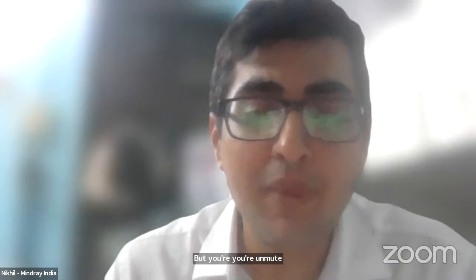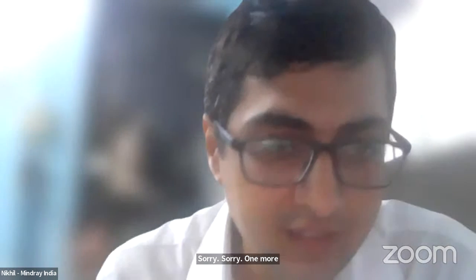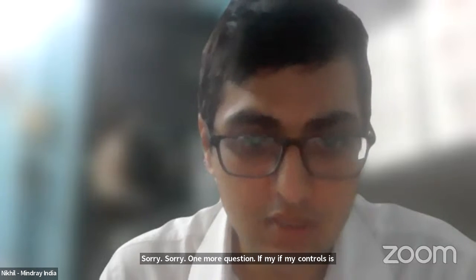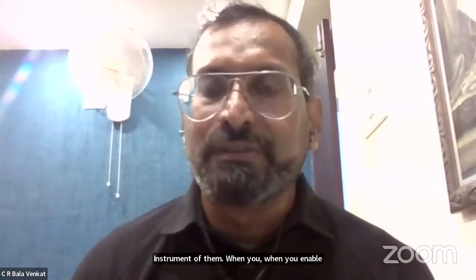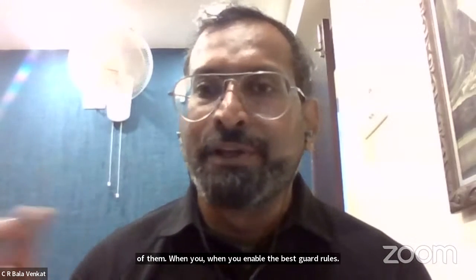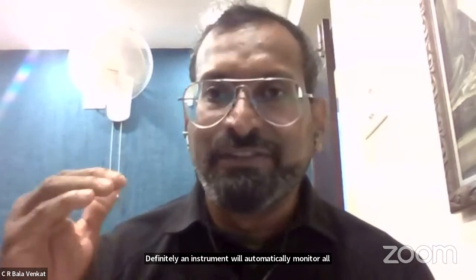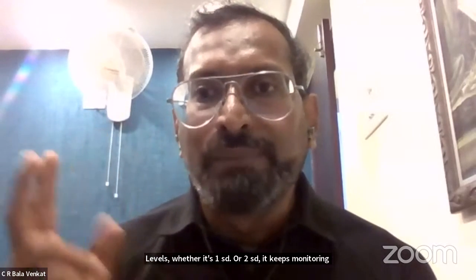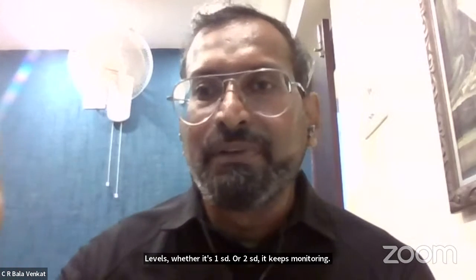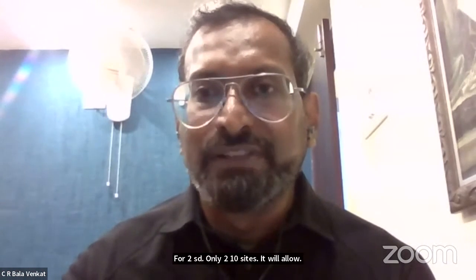One more question. If my control is -2 SD, is it acceptable for me to release the report? See, definitely it is releasable, but you have to see the instrument when you enable the Westgard rules. The instrument will automatically monitor all the levels, whether it is 1 SD or 2 SD. It keeps monitoring. For 2 SD, it will allow only 2 times. If a value comes on the 2 SD a third time, that is on the third day. The first day you run, it is on 2 SD.